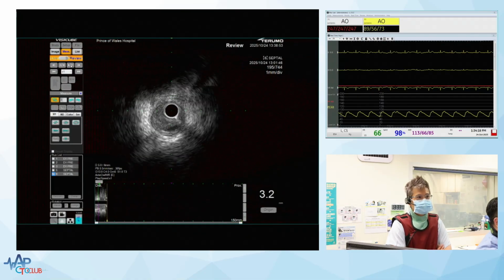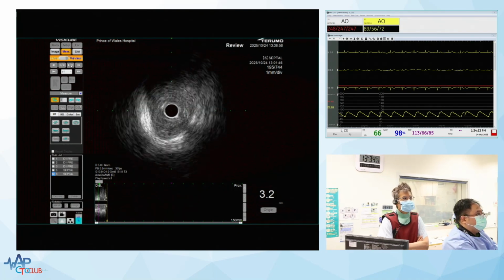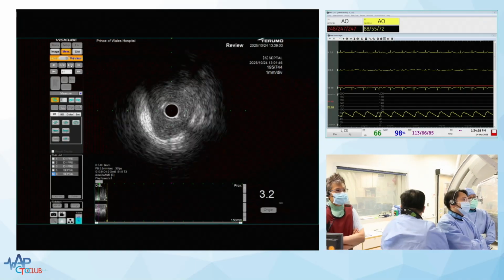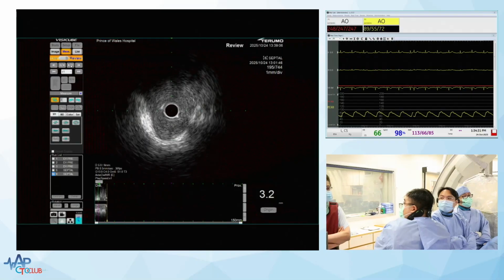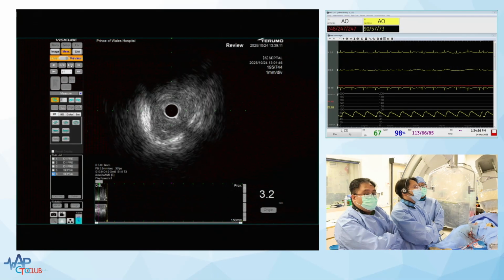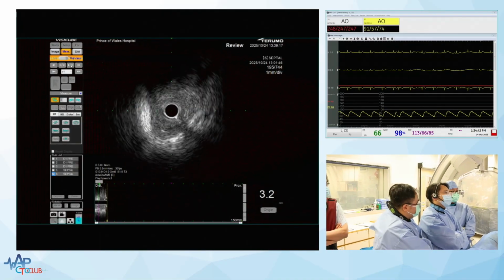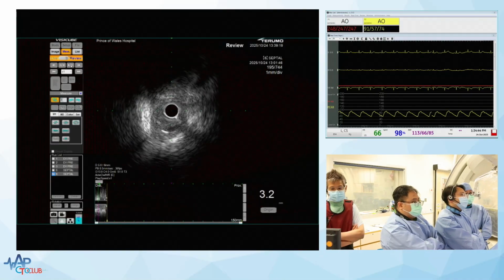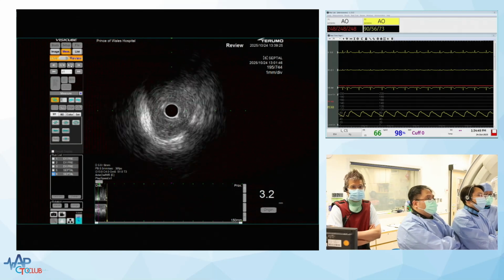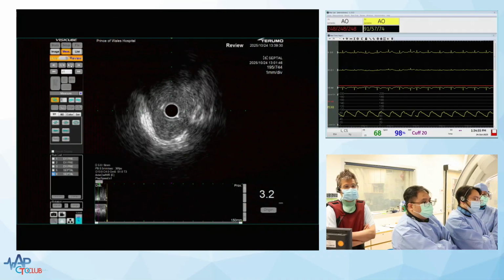So I guess the question really is you're asking about the quality of the distal vessel, right? And I guess there's two things. If you make a proximal cap puncture and a low force or medium force wire makes very easy progress, maybe 3D wiring is not required, right? But if you make the puncture and then there is considerable resistance, then probably 3D wiring is best because the distal target is relatively small, so it may be hard otherwise.